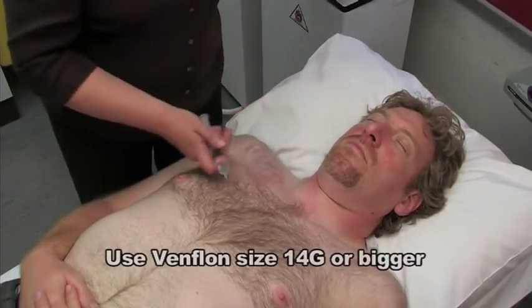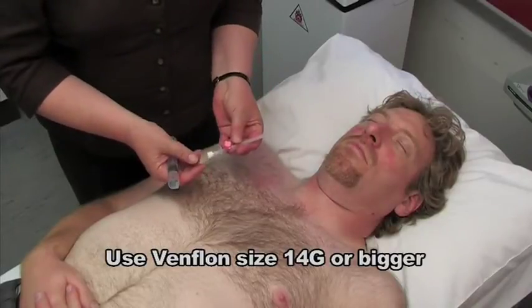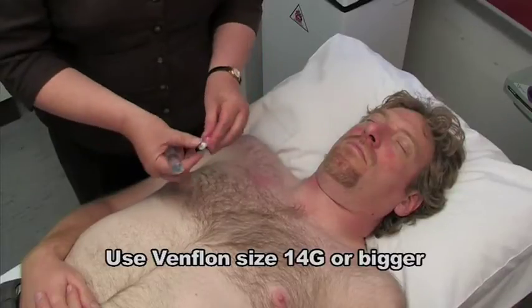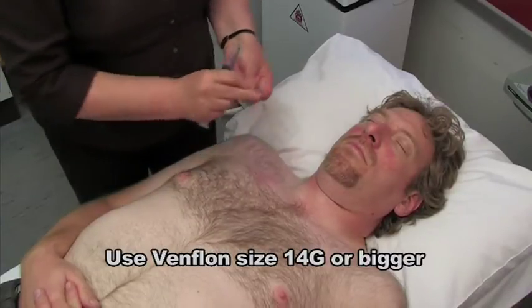Your equipment: a syringe with some water and an ordinary Venflon. The bigger the better. Remove both tops from the top of the Venflon.